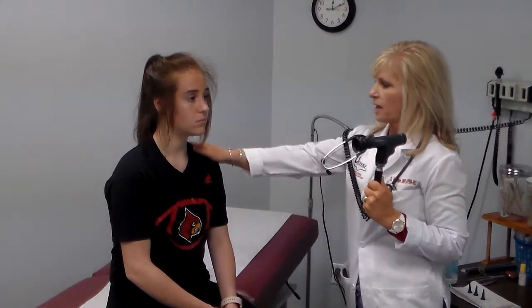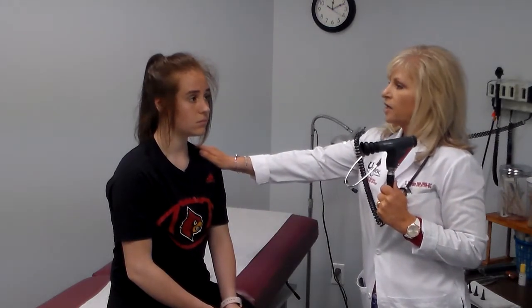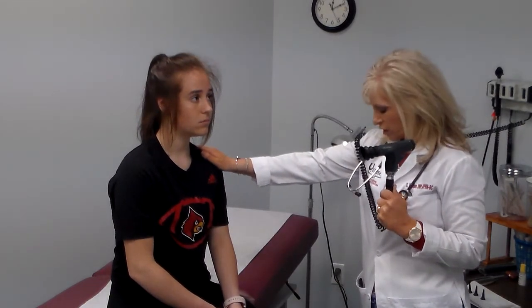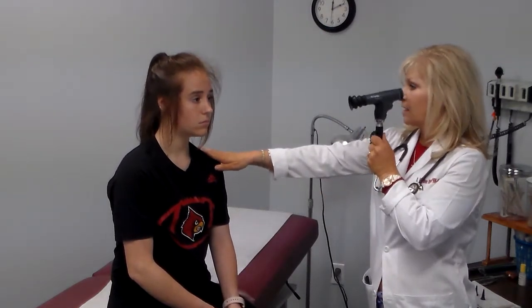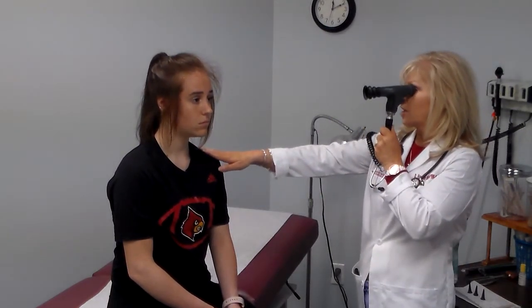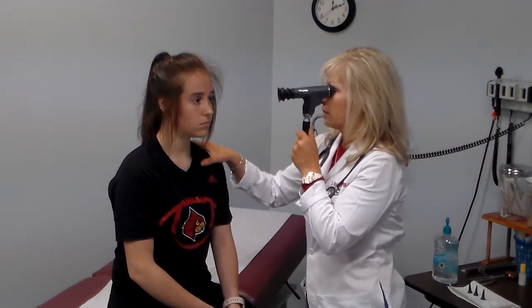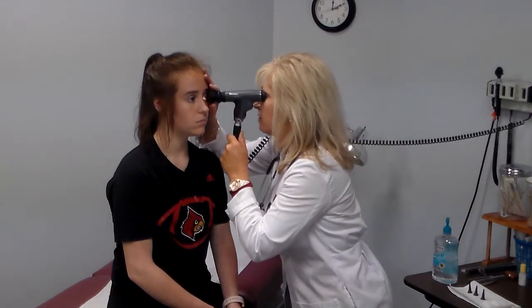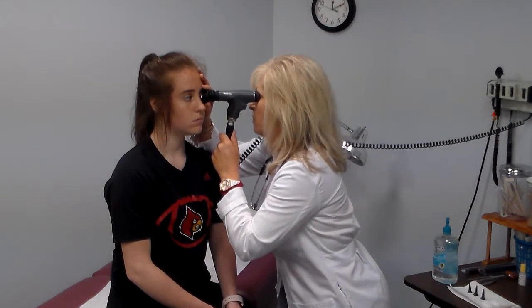Okay. Left hand to left eye. I'm going to put my hand on her shoulder. And as I approach the patient, I'm going to find the red eye reflex and then progress further in for the examination. I'm coming in at about a 30-degree angle. I'll tell you when I've got her red eye reflex. About right now. So now I'm going all the way in. And now I'm going to have her look into the scope.